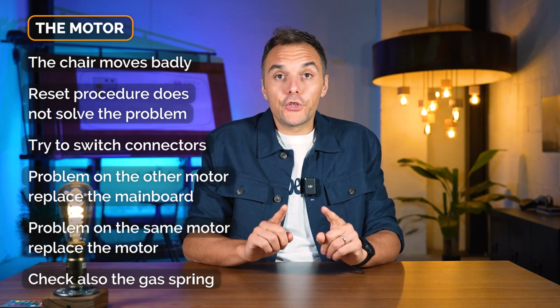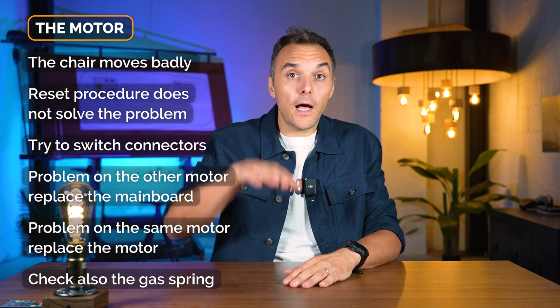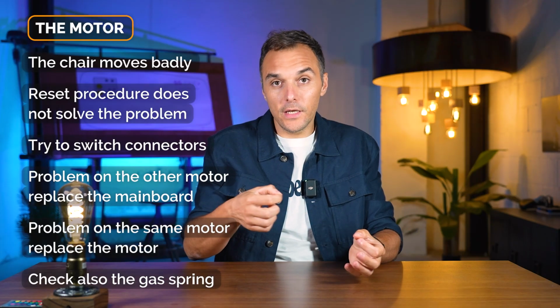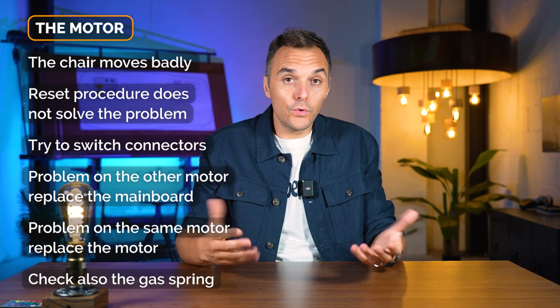When you do this checking operation, it is better if the dental chair is in a very up position, because we have the full extension of the gas spring. So in case you need to remove it, we can easily disconnect it without a big effort. It will be much easier to do this operation.